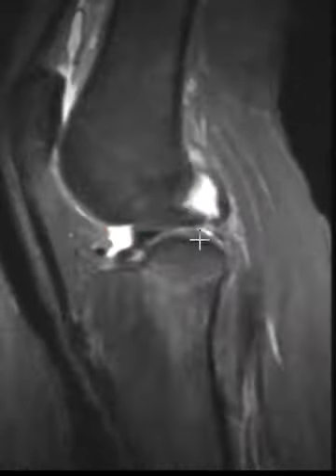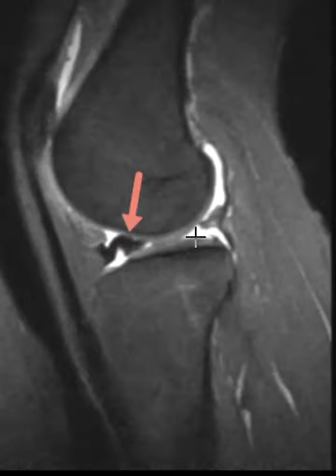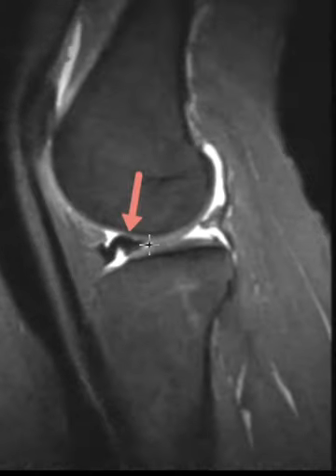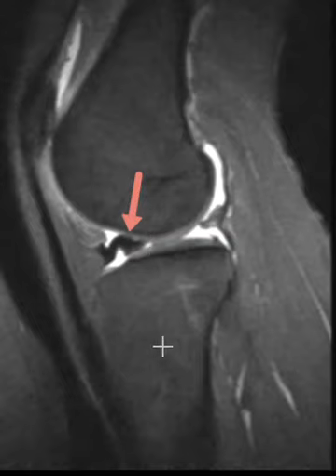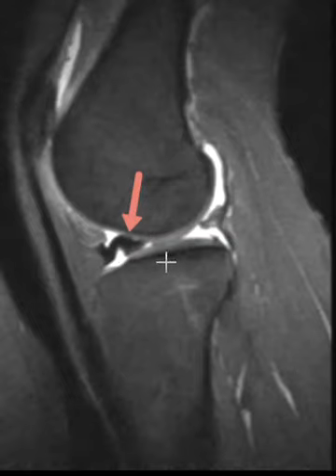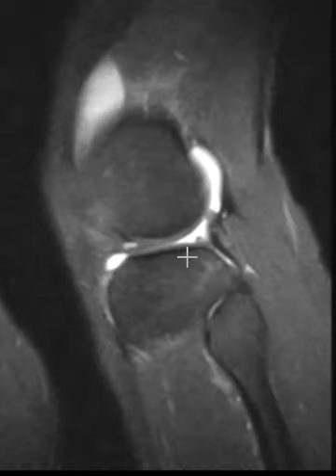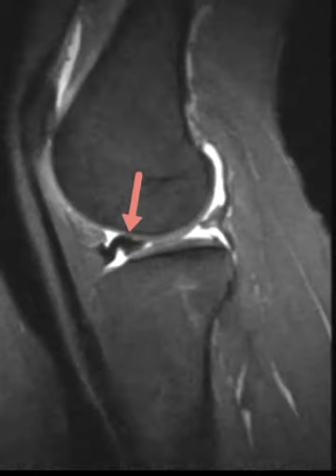This is what we call a bucket handle tear with a large displaced bucket handle fragment, and this will cause the knee to lock and become unstable. They can't really extend their knee because this fragment is in the way — not a terribly uncommon thing. Bucket handle tear of the lateral meniscus. Thank you very much.